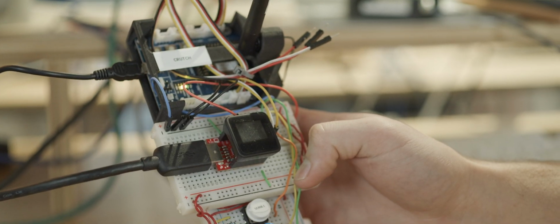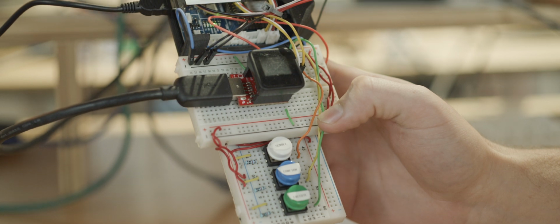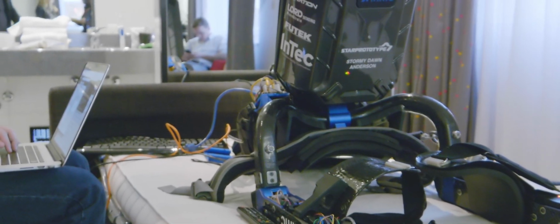And we decided that if I don't get this working in two weeks, then we're going to throw it in the trash and go back to the previous design. Just because we're hurting for time. And so if I can't get it working, we're just going to use this working solution. The only downside is that we have this tethered data connection.